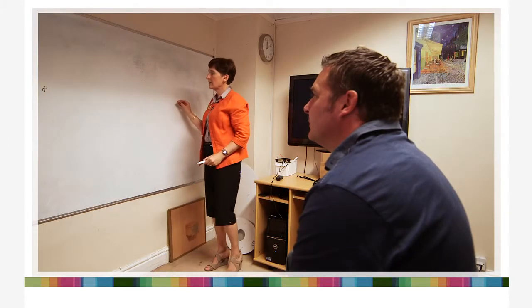So what I want you to do is keep your eye on that, don't move your eyes, and if I shine this light here, I want you to tell me as soon as you can see. You can see it now already? Can't do it again. No, I can't see there. So tell me as soon as you can see it. Yeah. See? Well done. And here?